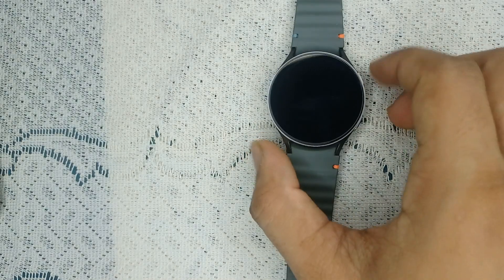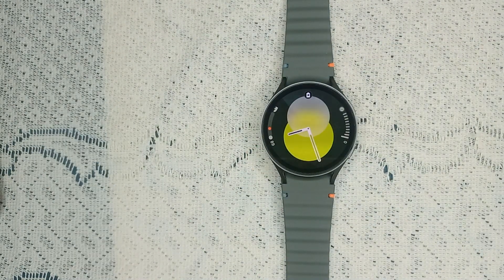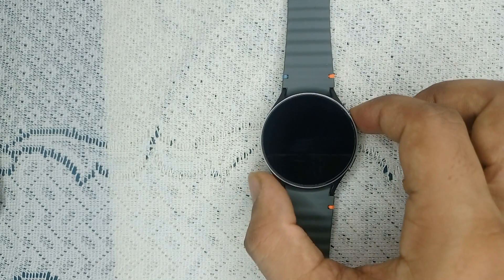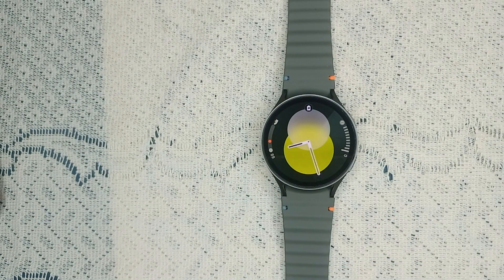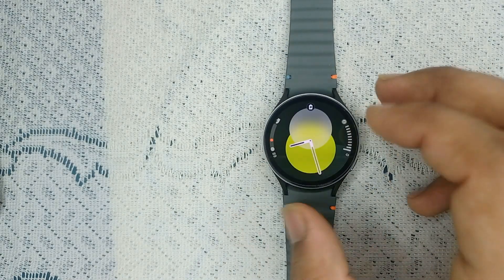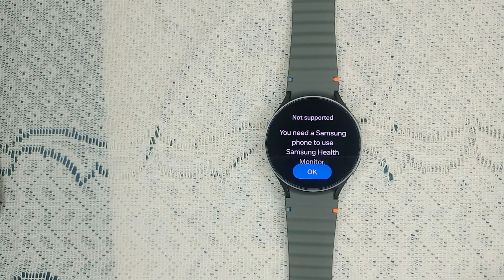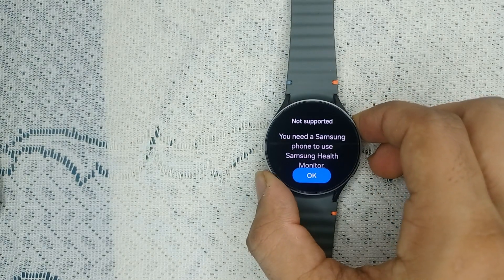The next step is calibration. Calibration is crucial for accurate readings. You need to calibrate your watch every 28 days — every month — otherwise the blood pressure feature will become inactive. Use a traditional blood pressure monitor and place the cuff on the opposite arm from where you wear your watch. Then open the Samsung Health Monitor app and follow the on-screen instructions to input your blood pressure reading from the cuff monitor.